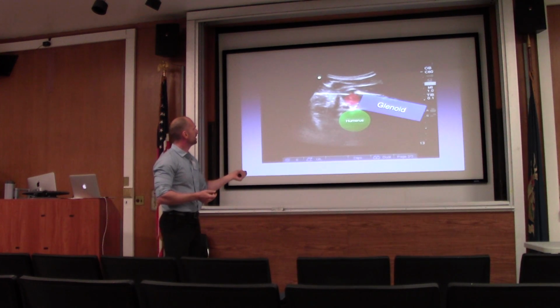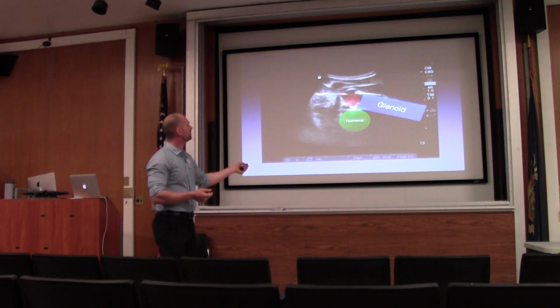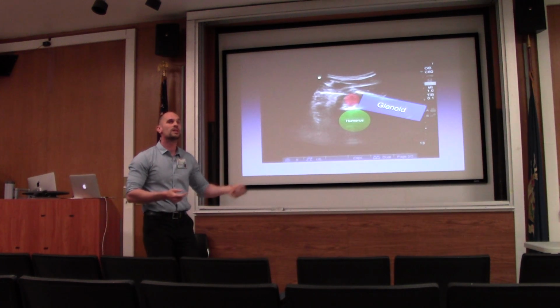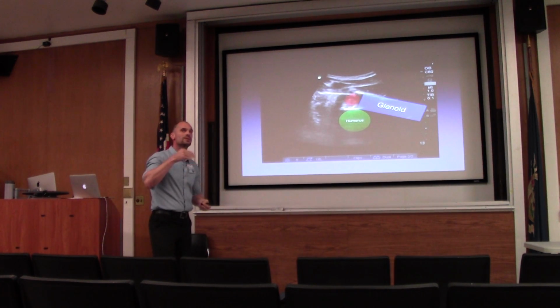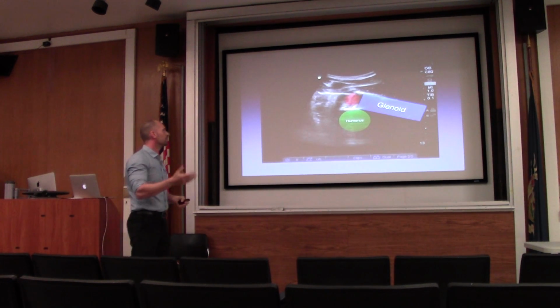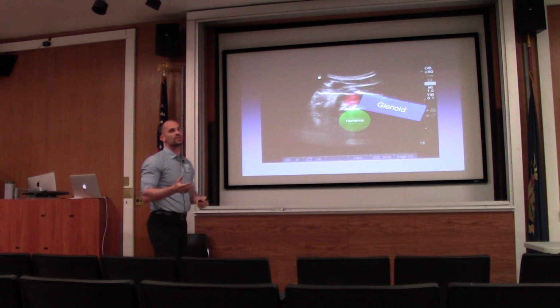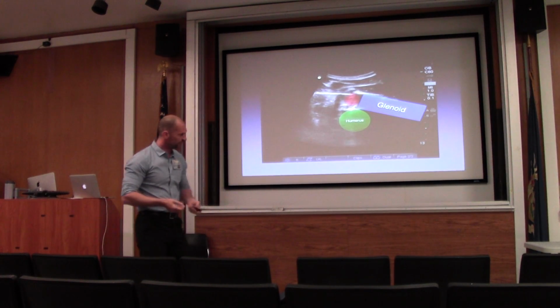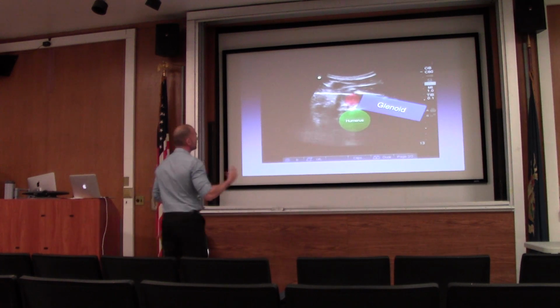Now, when you end up making this, I want you to also notice where it's not going, right? This fluid is not extravasating superficially. It's not extravasating deep. You can see it pretty much all contained. So the next point is that if you start to see a little bit of extravasation, just stop. Basically reassess how you're positioning, reassess where your needle point is, find your needle point if you don't know where it is, and then start over again.